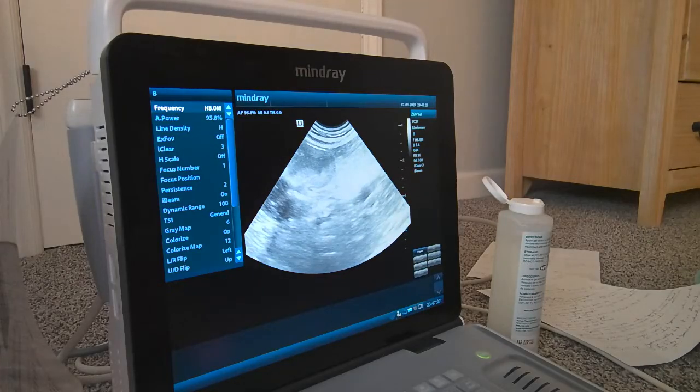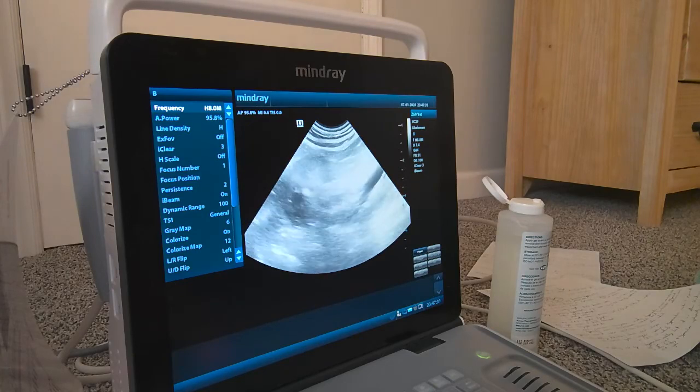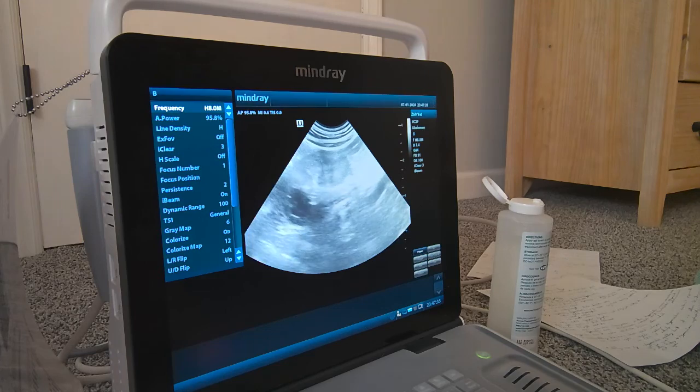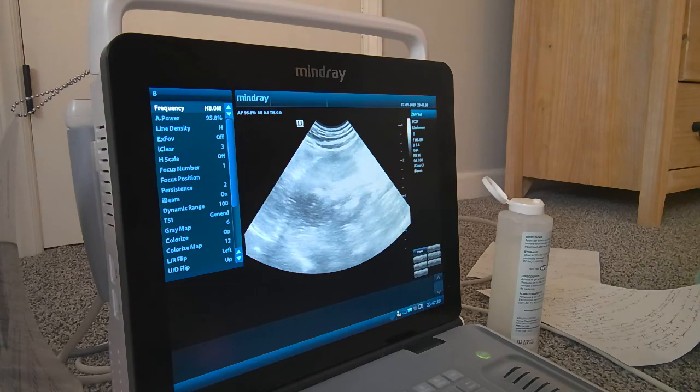All right. So next, I would actually like to take a peek at the kidneys. So I'm doing that right now. I'm kind of just caudal to where I was before with the spleen, and kind of coming up under the rib cage. Kidneys can be pretty far dorsal.